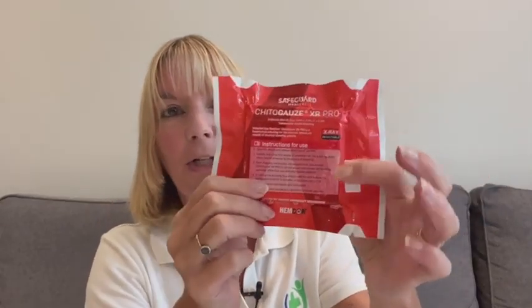If there is a lot of blood coming out of a gaping wound, like one of these, and direct pressure will not be able to stop it, then what you need to do is pack that wound. Inside your bleed kit, you will have something called Celox or Chitogauze or something like that, which is in a little compressed bandage type pack. Inside there, you will have gauze which is coated with a clotting agent. What you need to do is find the source of the wound and pack it in firmly to stop the bleeding. This clotting agent will help to clot that wound and make it seal as quickly as you possibly can.